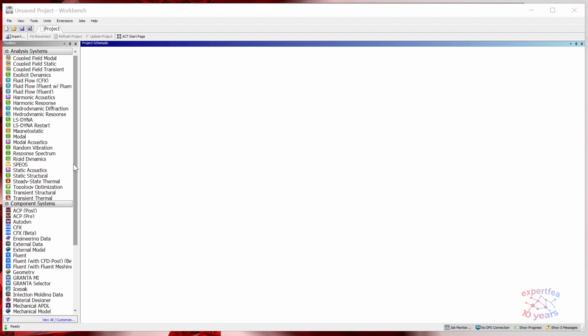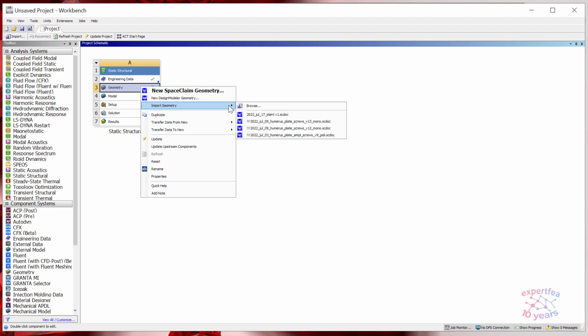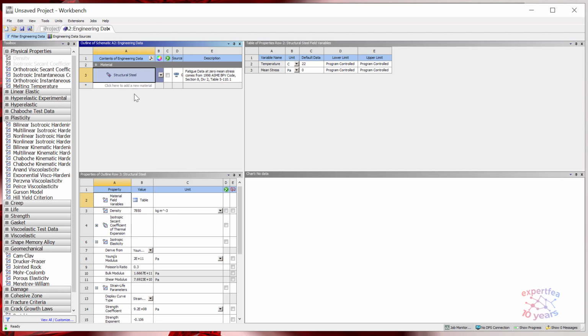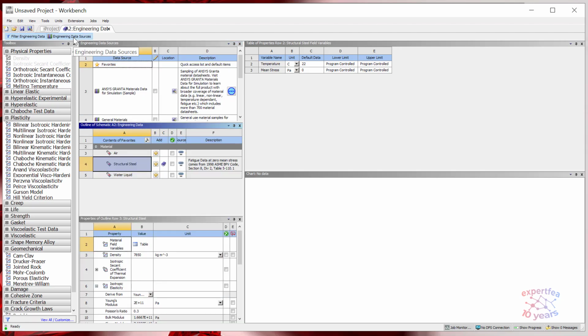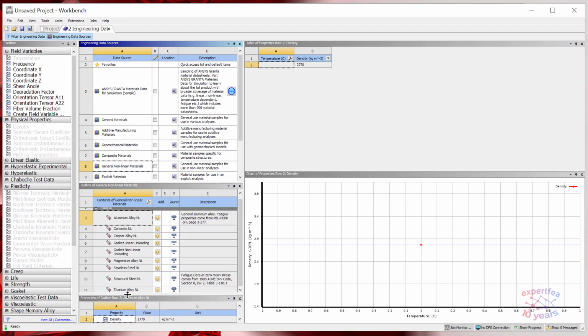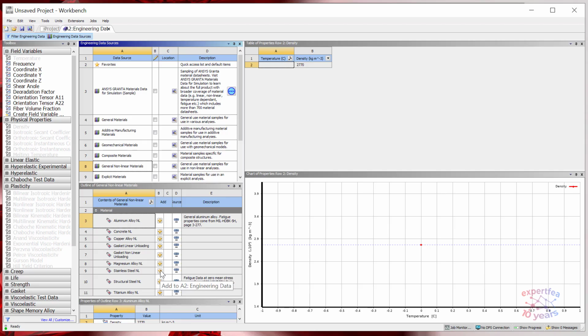Now that we have the geometry made, let's perform the structure simulations. We'll drag and drop a static structural simulation, then import the geometry. Now we're going to create the proper materials. For the stent, we'll choose a non-linearly defined steel. So let's go to engineering data sources and access general non-linear materials. We're going to select structural steel. Let's say stainless steel, why not?